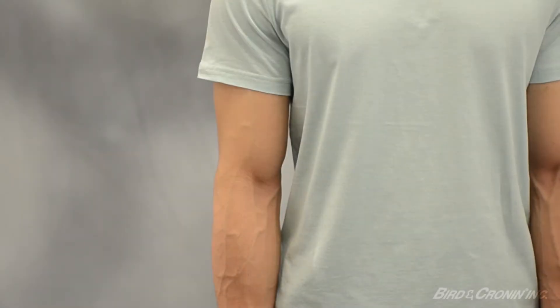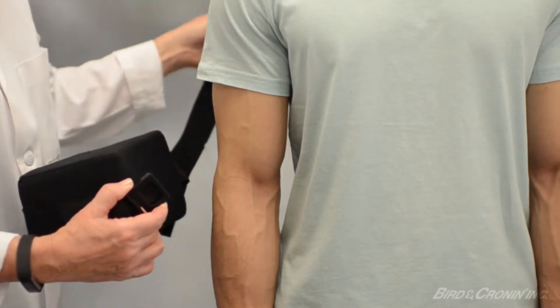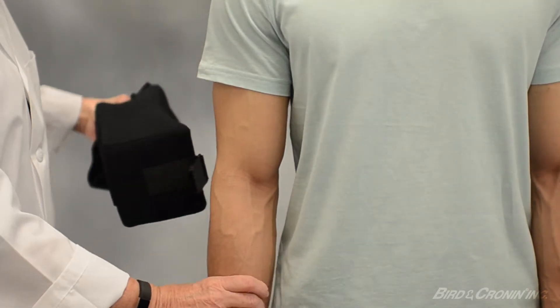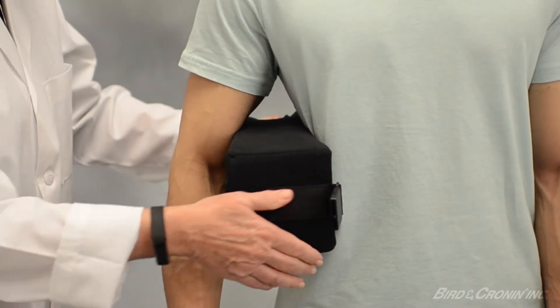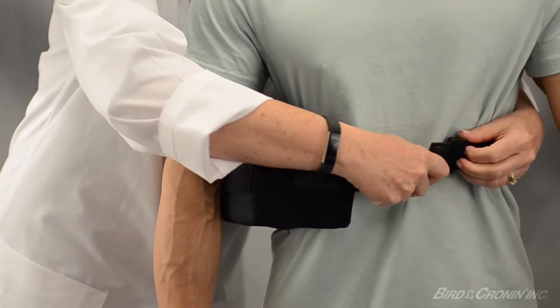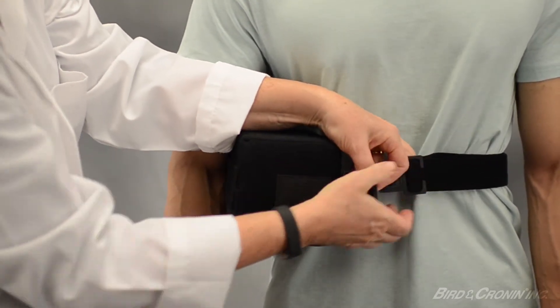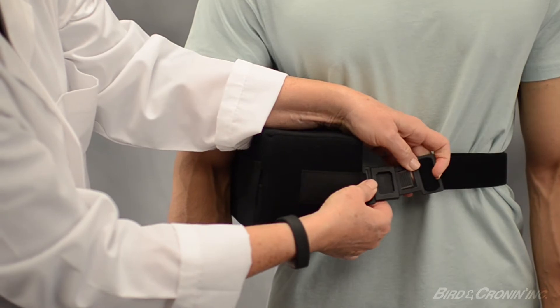We will begin with the abduction pillow application. Release the buckle on the waist strap. Place the pillow between the affected arm and the waist, making certain the buckle is in the front for patient access. Wrap the strap around the waist and attach to the pillow by securing the buckle.